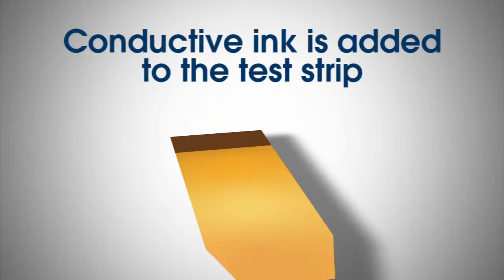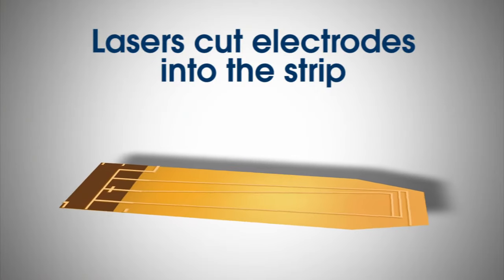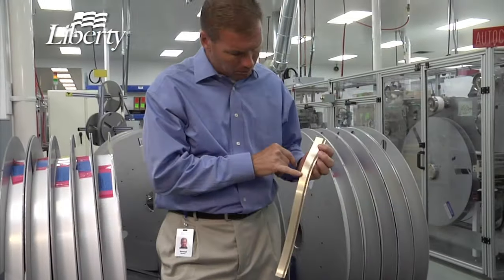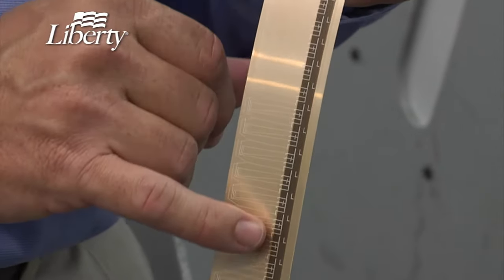The first step is to run this material through a machine that puts a conductive ink on the end of the test strip. Next, we use lasers to cut four electrodes into the strip. Lasers are used because they are incredibly precise. Two of the electrodes ensure an adequate blood sample, and the other two measure the glucose reaction.